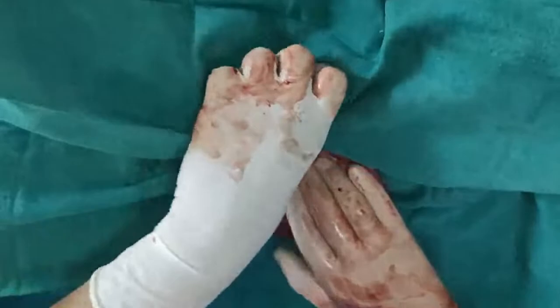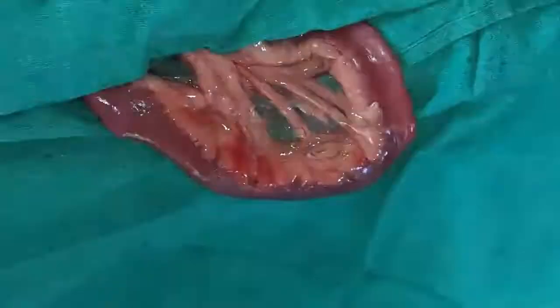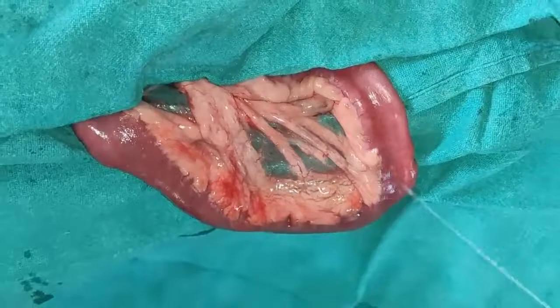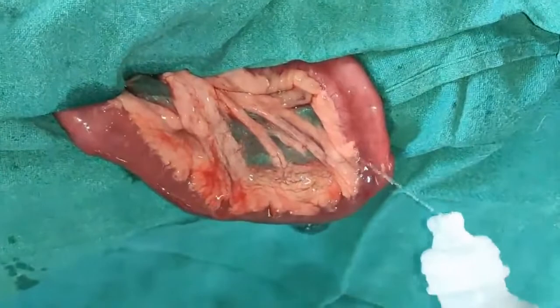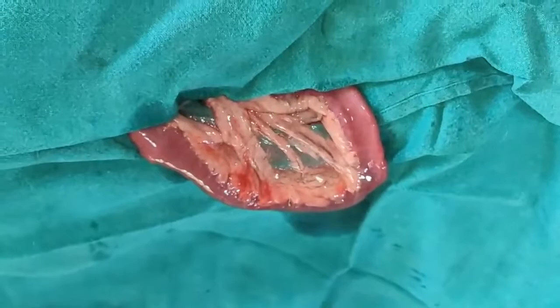and then suturing. So you can see here, this is the obstructing mass. So we should put normal saline here. If you don't have any assistance, it is better to keep one drape gently and use this NSS bottle and spray over that. If you don't have any assistance, you can perform that.